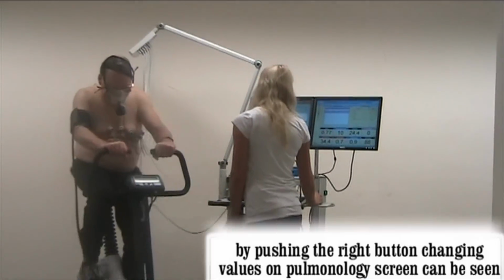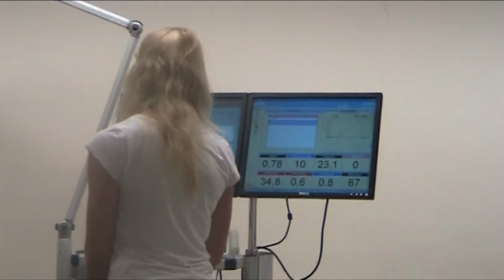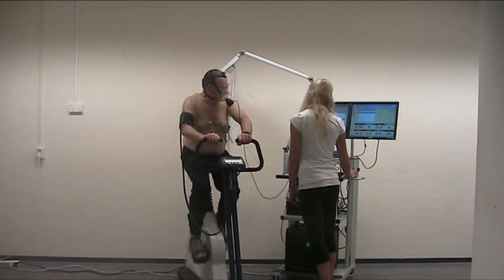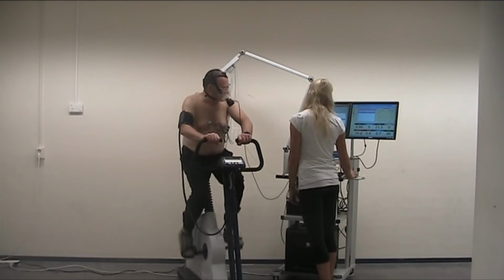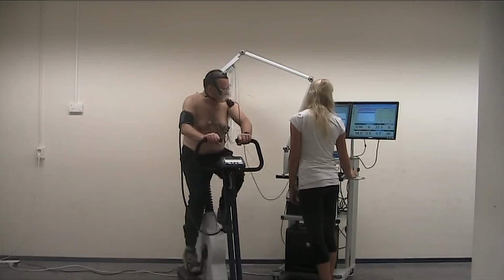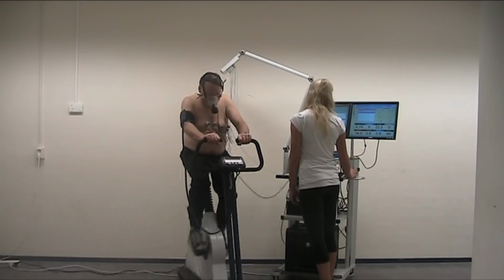The values will show up directly on our monitor and can be read by the therapist during the test. In the 8 boxes at the bottom, you can see the values being measured. The most important measures for us are the RER, the CO2, the O2, the ventilation, and the heart rate.